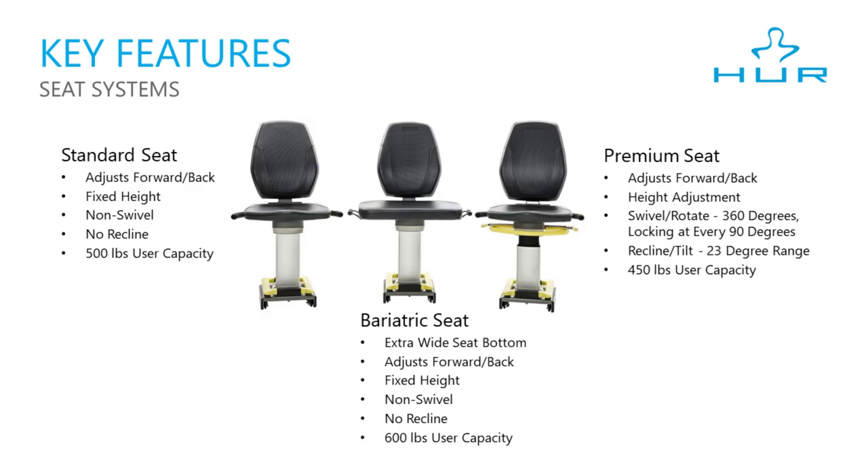There are three seat systems: standard, bariatric, and premium. The premium seat is the most widely used in senior living communities because of its features. With it, you can go forward and back, adjust the height, and the seat will rotate 360 degrees, locking every 90 degrees for easy entry. It will also recline with a 23 degree range, adjusting hip and knee angles for ideal flexion. It has a 450 pound capacity.